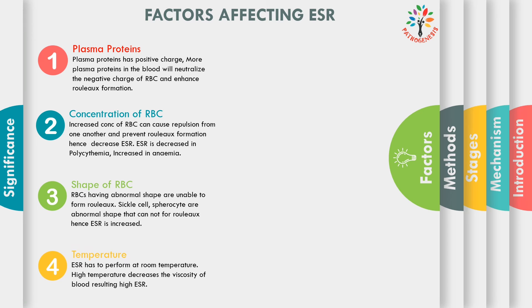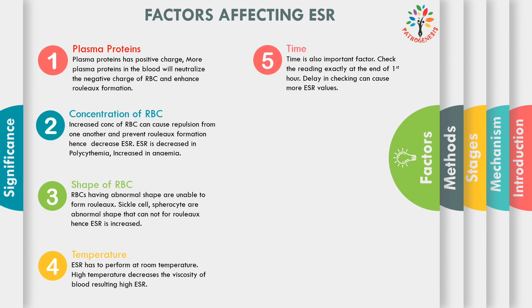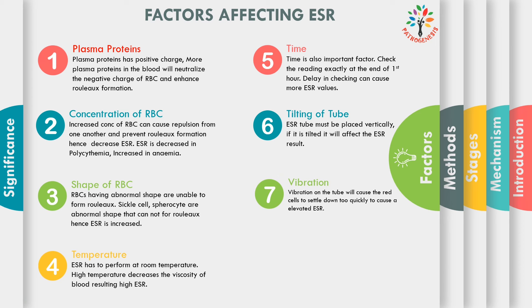Fourth, temperature: ESR has to be performed at room temperature. High temperature decreases the viscosity of the blood, resulting in high ESR values. Fifth, time: you have to check the reading exactly at the end of the first hour, as a delay will cause higher ESR values. Sixth, tilting of tube: the ESR tube must be placed vertically; if the tube is tilted, it can affect the ESR result. Seventh, vibration: vibration of the tube will cause the red cells to settle down too quickly, causing an elevated ESR level.